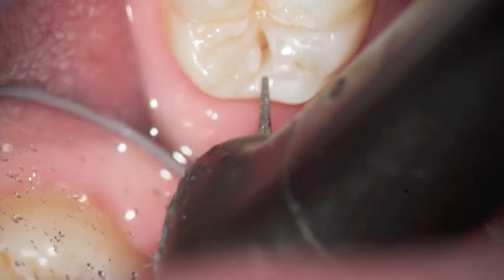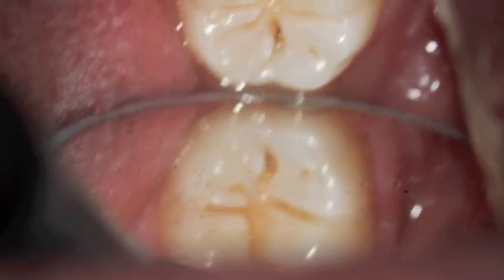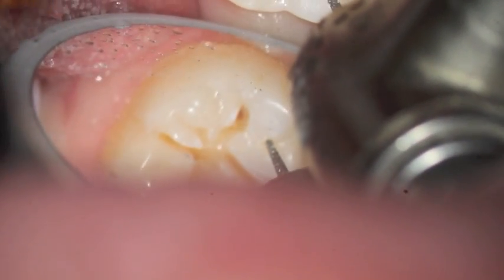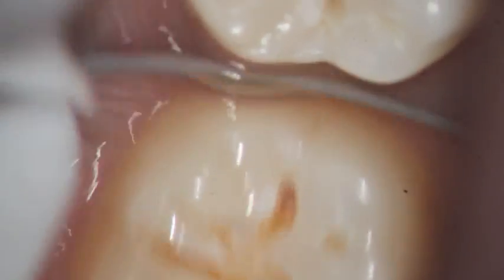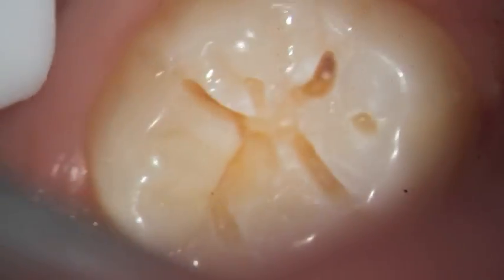And the question is when do you stop? When do you know that you've got everything out? And in this view, you can see on the distal or the end part of that tooth there how much more brown there is. And if you compare it from where we started from, that's really quite large. And that's because the acid gets through the hard enamel, and then once it touches dentin, it spreads. And the dentist needs to remove all of that.